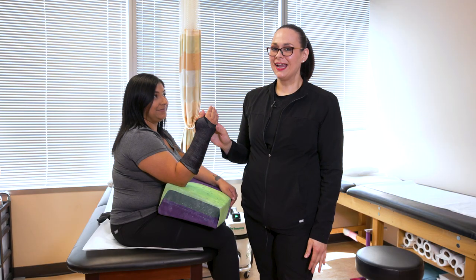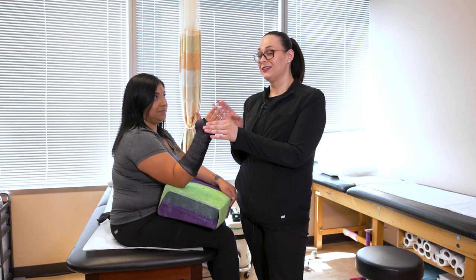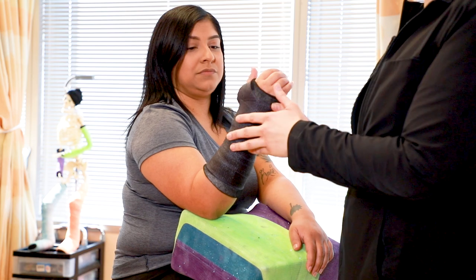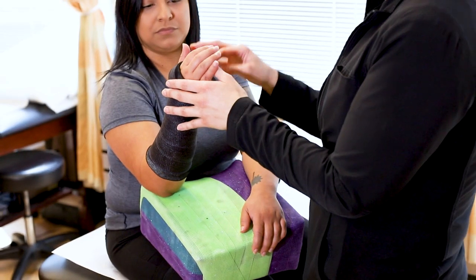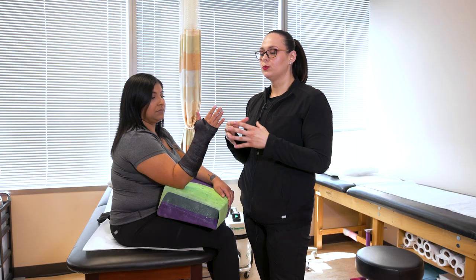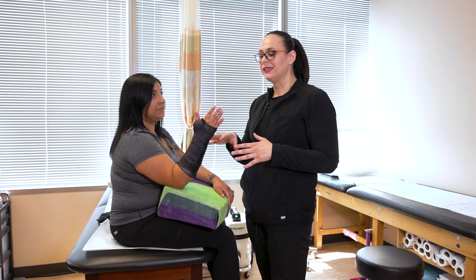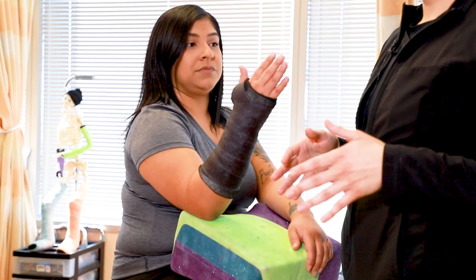A few cast care tips to remember: you need to keep this cast dry. We're not worried about the outside of the cast getting wet — the fiberglass portion is okay — what we're really worried about is the inside of the cast. If your cast gets wet on the inside, that creates a lot of moisture, and what can end up happening is your skin inside can start to macerate, so we want to avoid that.